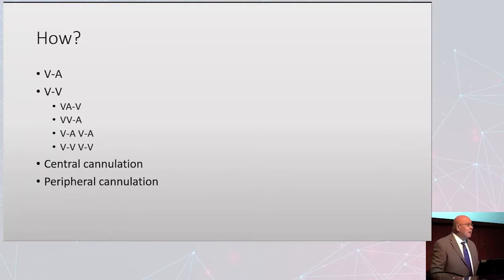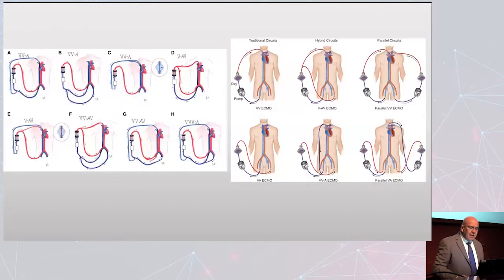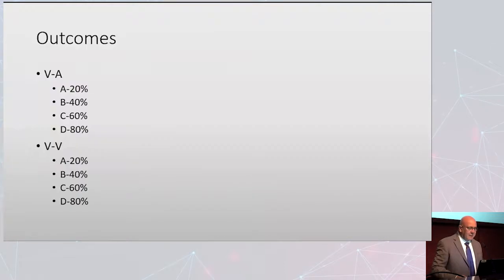We can have central cannulation. We can have peripheral cannulation. You can have combinations of those cannulations. So really, at the end of the day, there's all kinds of ways, all kinds of places to put these tubes. Where you put them, however, is going to depend on what you're trying to accomplish and whether you accomplish it well or not. Here's just a diagram of all the available options. I won't go through them all, but you can see the ones on the far right of the screen being the butterfly technique. You have dual circuits, and the ones on the left are different iterations of VVA, VAV, and so forth. So you can review all of these at your leisure, but suffice it to say, this is only a partial representation of all of the different things that you can do.